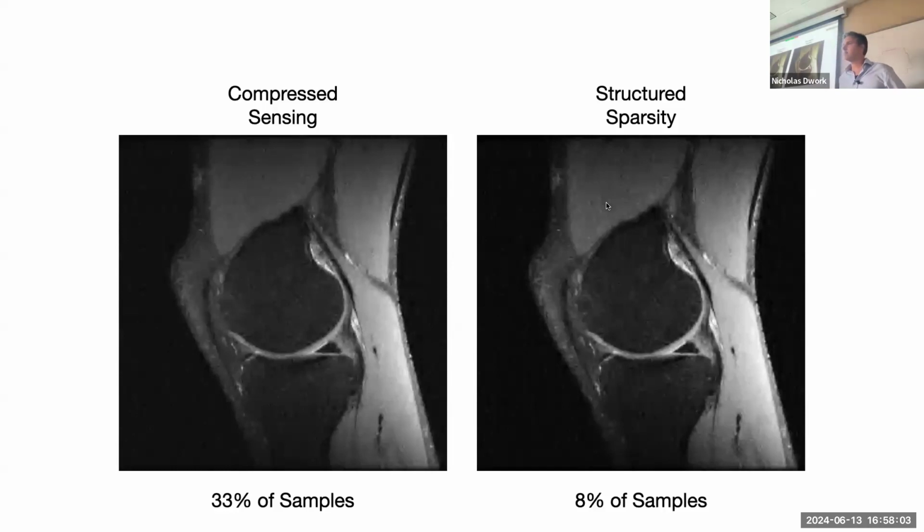But if you want to throw in TV, then you will need a regularization parameter, because you'll have to balance it with the wavelets. It'd be questionable why you would do that, because TV penalizes the norm of the first order difference, and the first order difference is like a high pass. So we're already penalizing that in a sense. But I never liked it.